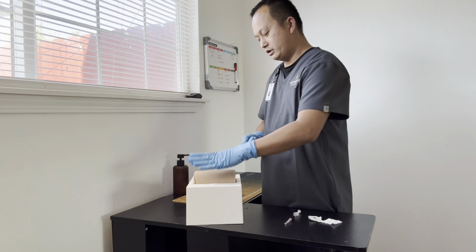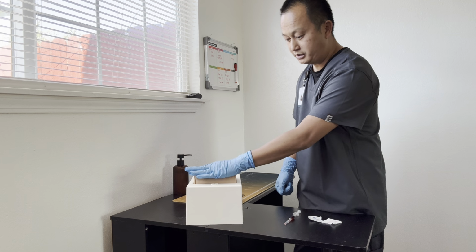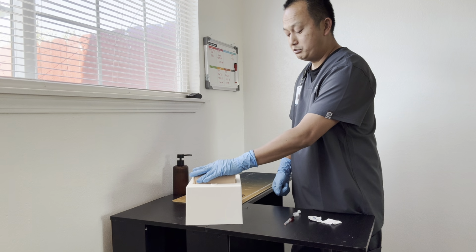We will use our thumb to make sure that it's facing towards the patient's groin. Our index finger is going to be on top of the anterior superior iliac spine, and then our middle finger will be on top of the iliac crest. Our site will be in the middle between our middle and index finger. Once we find our site, we're going to use an alcohol pad to clean the site in a circular motion from the inside to the outside up to 2 inches.